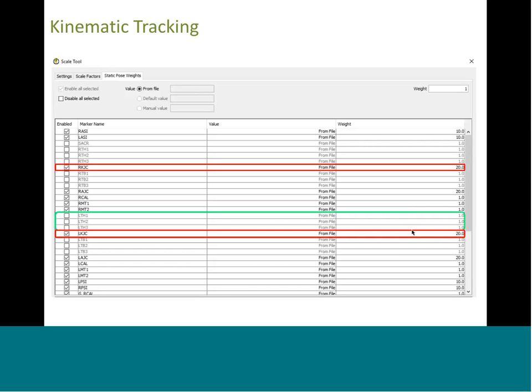One benefit of having a model that uses weight to minimize errors across all markers is that it's resistant to individual markers with large errors, since you can always weight markers less or give them no weight at all. If you're worried about having noisy markers, having more tracking markers will give you more freedom in marker weighting and are therefore useful for calculating accurate joint angles.